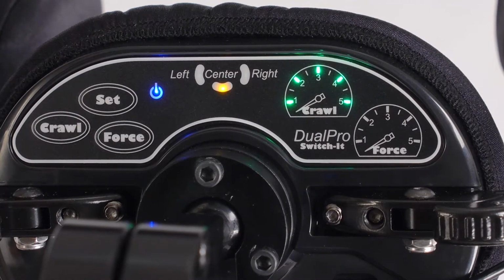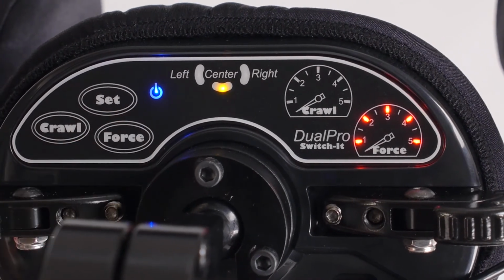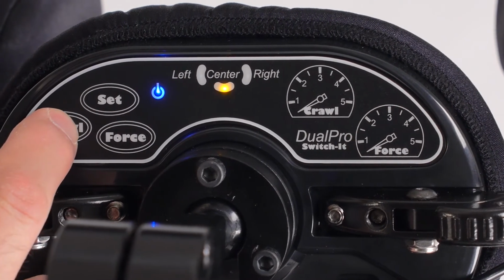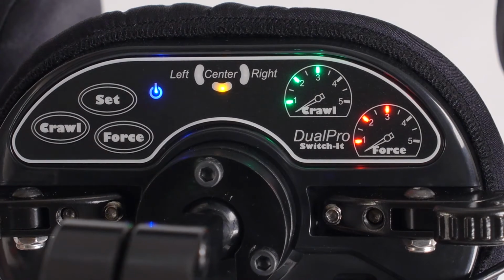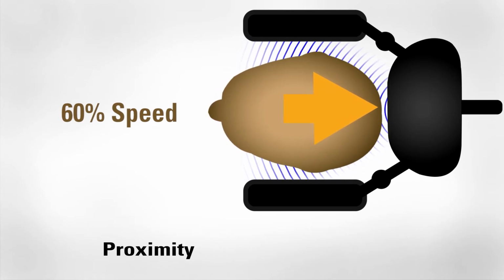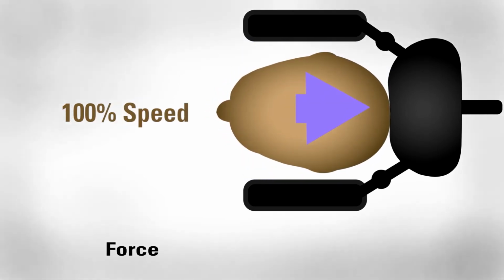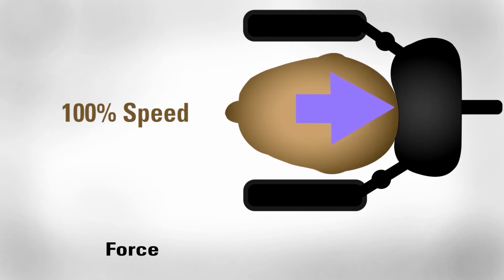Any one of the 3 pads can be set to respond to only proximity, only force, or a combination of the two. So for instance, if the crawl is set to 3 lights and the force is set to 3 lights, the chair will achieve 60% of its speed using the proximity of the user's head to the pad and the remaining 40% by pressing against the pad with a moderate amount of force.